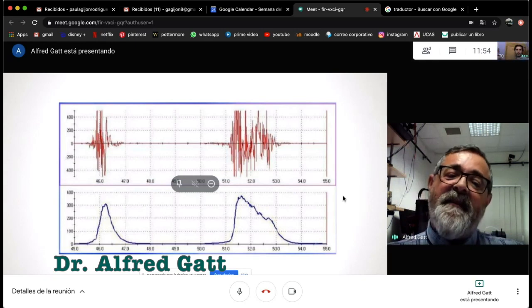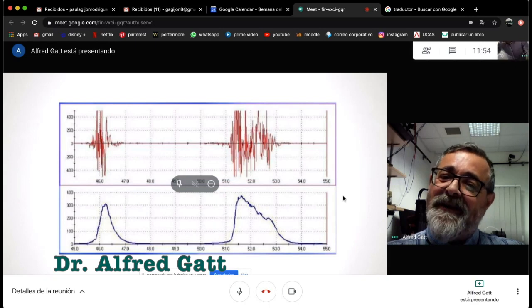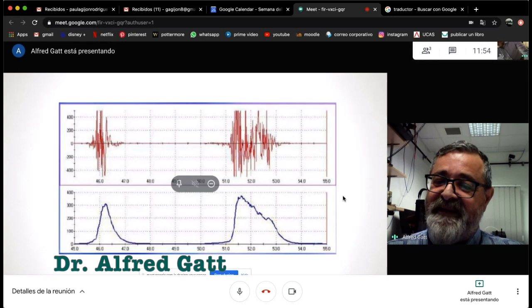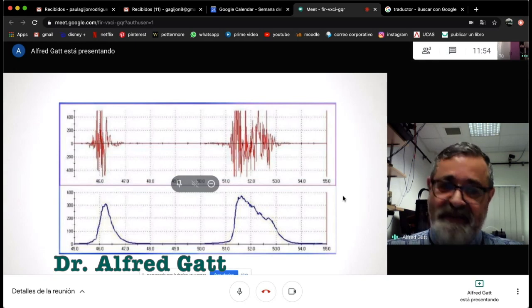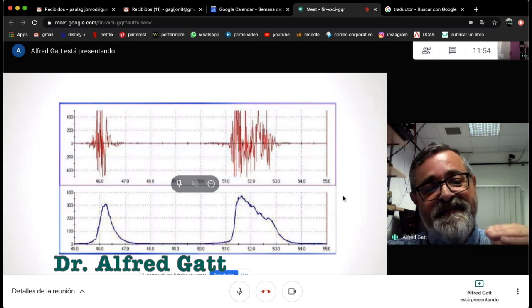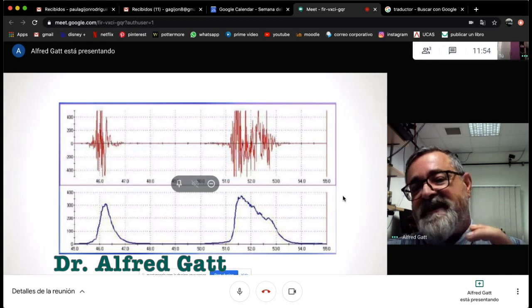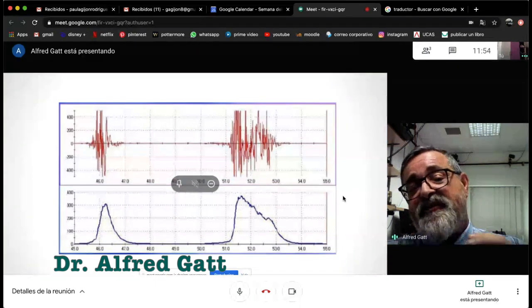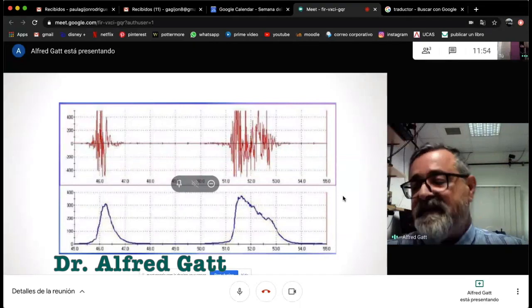Another piece of information, which is also very important, is the amplitude, the magnitude of the signal, which, although it does not really mean the force which is exerted by that muscle, does give us a relative number which can be related to the force, or which can be related to other muscles, for example, how strongly these muscles can be activated.